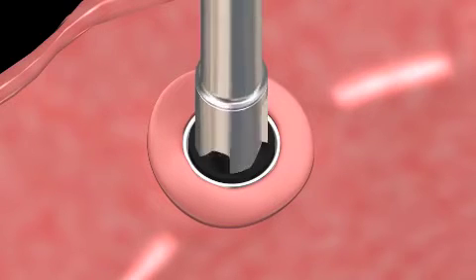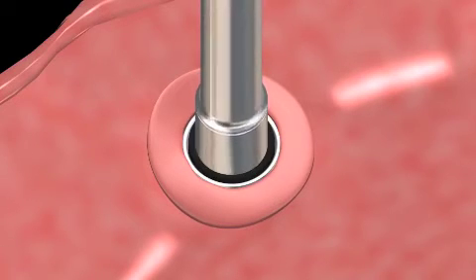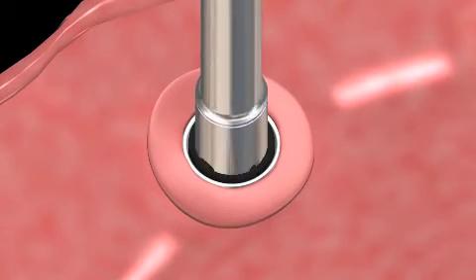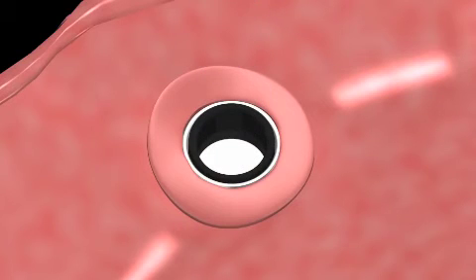Use the micro ERA core cutter in a straight handpiece at medium speed to cut out the center button of the black male. Use no more than three short in and out cutting cycles.